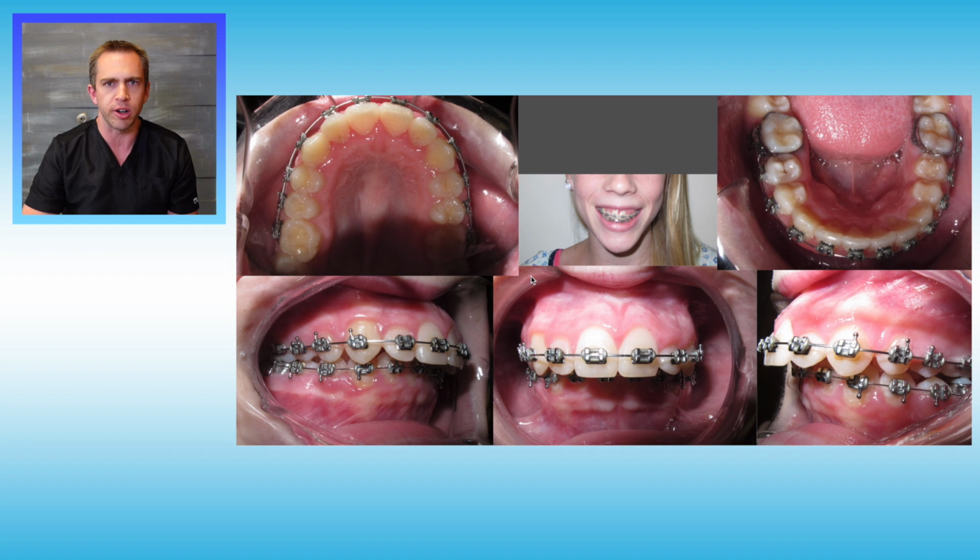So I'm going to talk you through this video as we go through these slides. We'll show you the actual photos of this patient. And this is the first day that we saw her in our clinic. As you can see, she already has braces on her teeth.